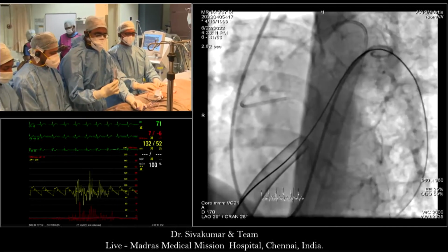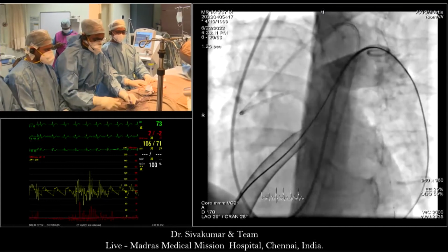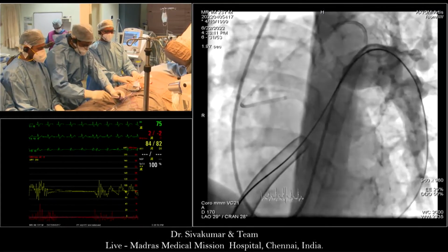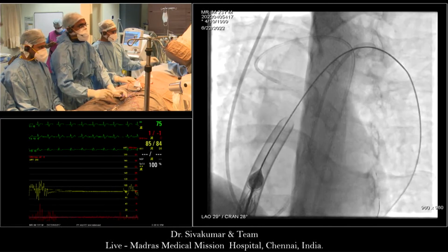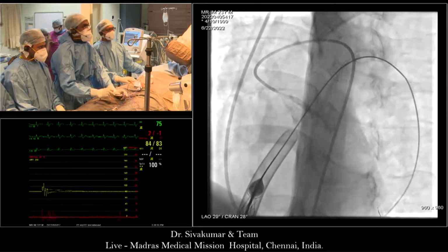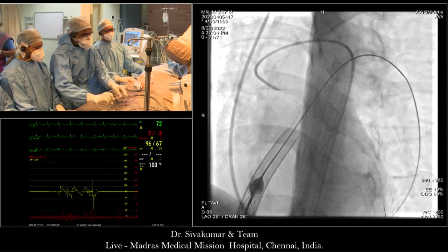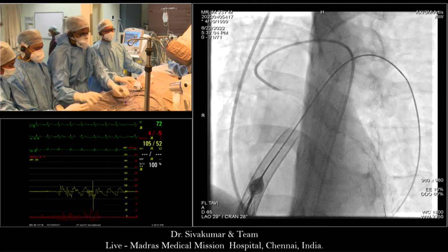Shaq, the length of the right ventricular outflow tract in this patient was 35 millimeter. So we asked Venus whether they can make a 35, but then they mentioned to us that they have only 30, and so we are taking a 30. It's a long RVOT.